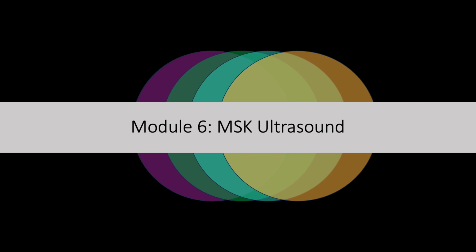I'll be upfront and say that since my training was mainly in the inpatient and emergency room setting, MSK ultrasound is one of my weaker areas. But that being said, I hope we can learn together and benefit from the expertise of our sports medicine faculty and fellows who use this modality day in and day out. As with other areas of POCUS, what I'll be going over is just the tip of the iceberg. There are some deep wells here into which you can dive, but we'll remain focused on general concepts and a focused look at some of the most common clinical questions seen in the primary care office.